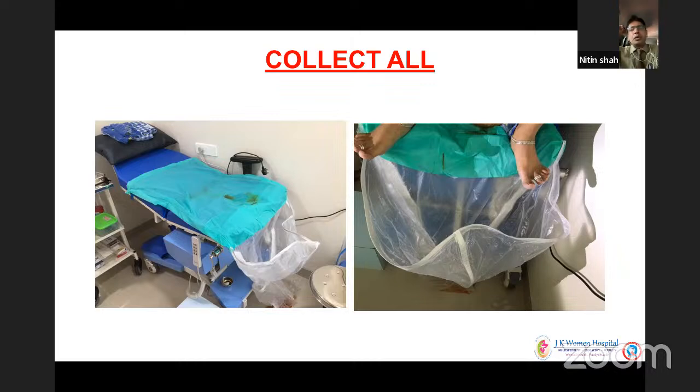Once you finish 3 to 4 liters of saline, we always ask anesthetists to give furosemide 10 milligram IV. Perfect. We always put a Foley for the operative patient. So as a prophylactic, after 4 liters, you give furosemide.